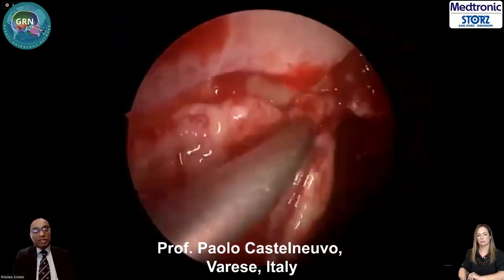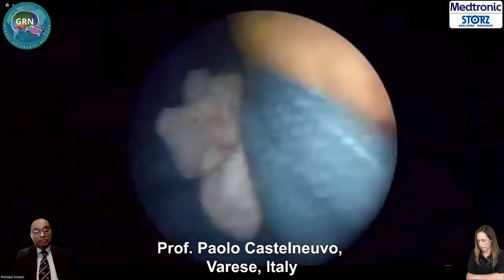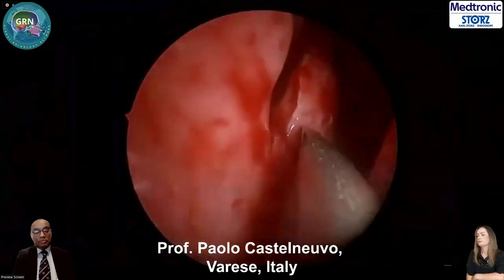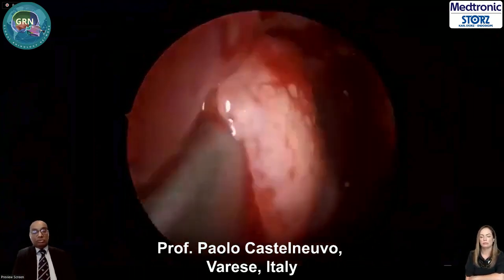Are you still considering the pre-lacrimal approach, Prof? Yes, I do perform a prelacrimal approach. And then I want to see the axilla of the inferior turbinate.